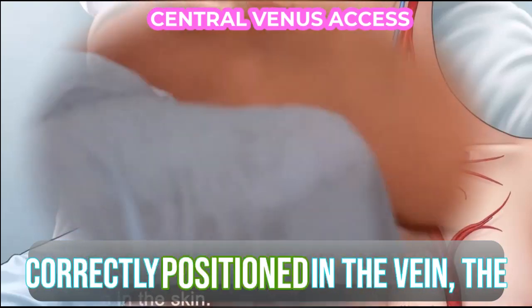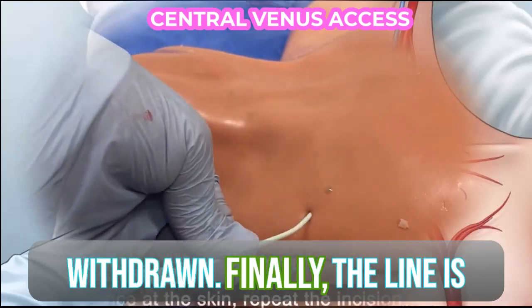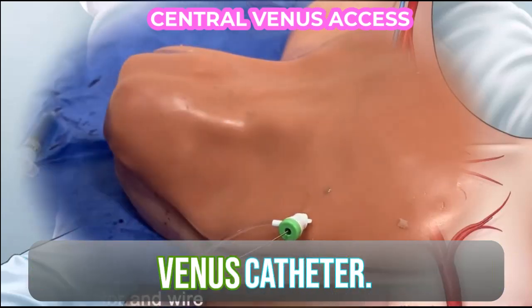Once the sheath is correctly positioned in the vein, the dilator and guide wire are withdrawn. Finally, the line is secured, flushed, and dressed in the same manner as any other central venous catheter.